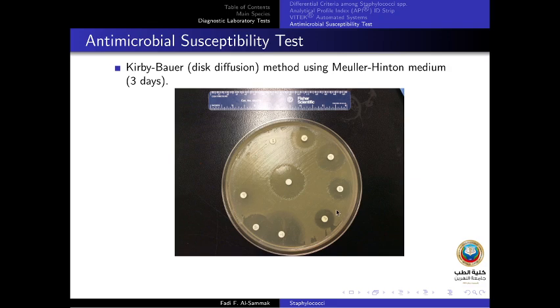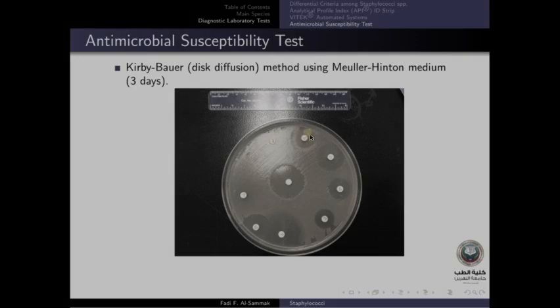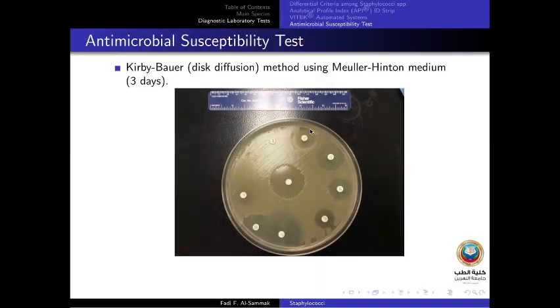And after deciding which antimicrobial discs to include in our test, there will be another incubation. And after incubation, we see here some will be resistant, as you can see here, and some will be sensitive. Why? Because there is an inhibition zone. This is the zone of killing of microbes. So we have different circles, different diameters.